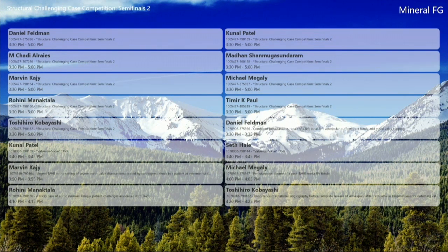And how did you size the AVP2? Generally we just start with a 12 millimeter, and we had a measurement from our CT that was, I think, 6 millimeters in diameter. We often just start with our 12 unless we know it's a lot bigger or a lot smaller, and see how it fits. Okay. And what kind of clip was it? Was it XTR or? It was an NTR. An NTR, okay.